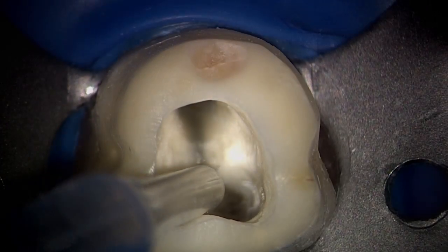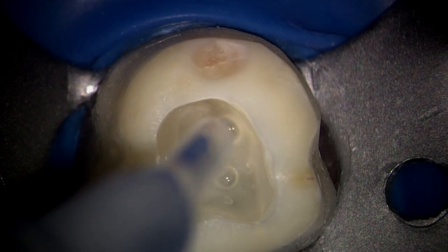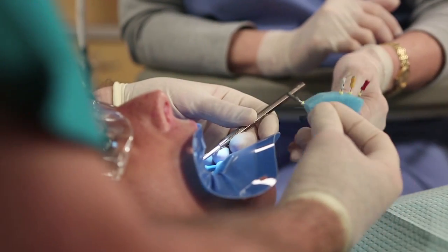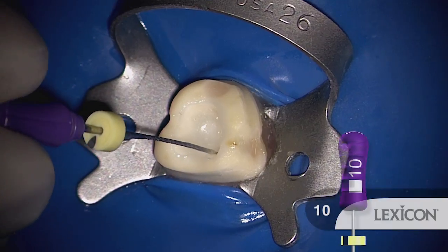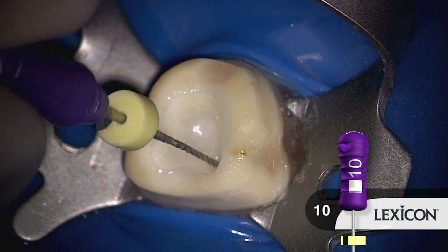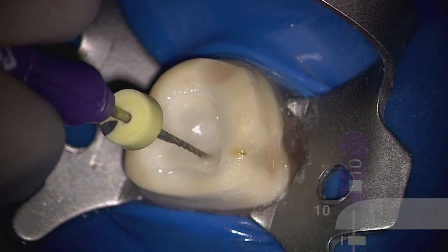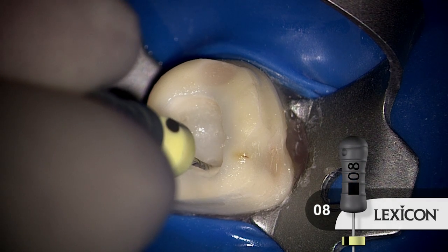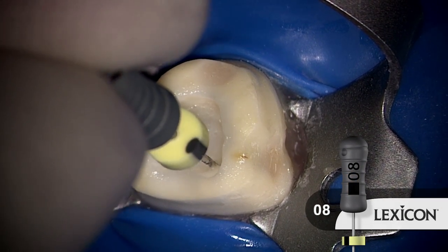Here, I'm placing a viscous chelator, such as ProLube. Let's talk just a little bit about glide path management. It's really important to secure canals and have a smooth reproducible glide path before we ever entertain shaping canals with rotary files. In this instance, if the canals are longer, more narrow, and curved or recurved, we might have to drop to an 08 to reach length.